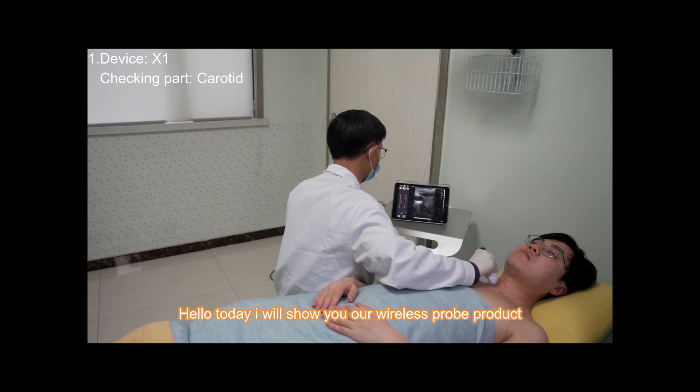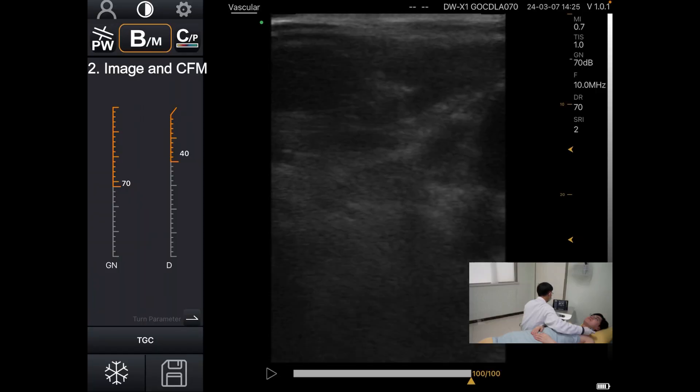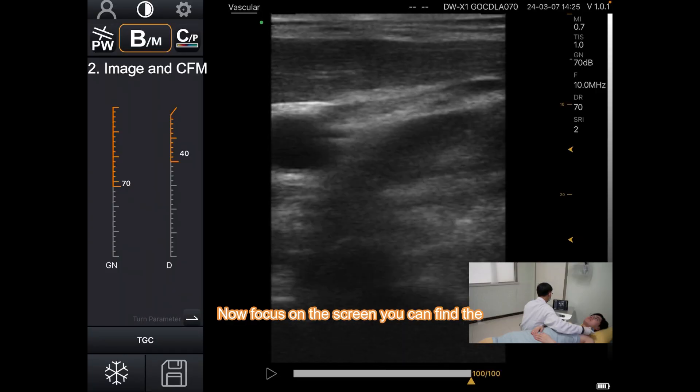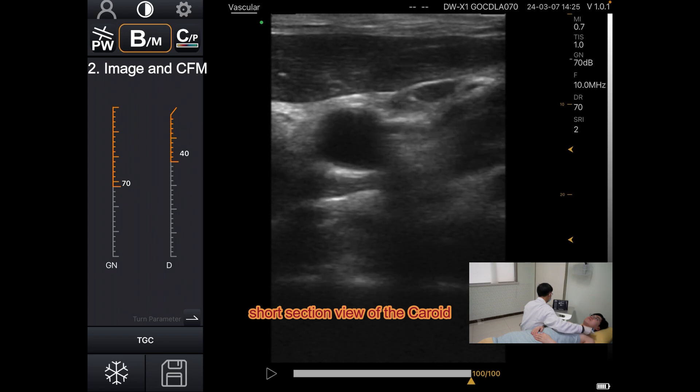Hello, today I will show you our wireless probe product named X1 and to check the carotid. Now focused on the screen, you can find the short section view of the carotid.